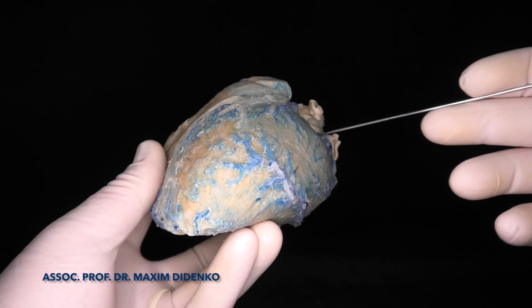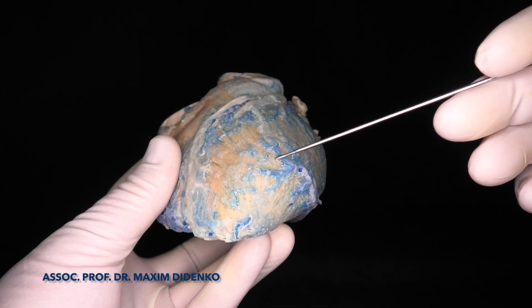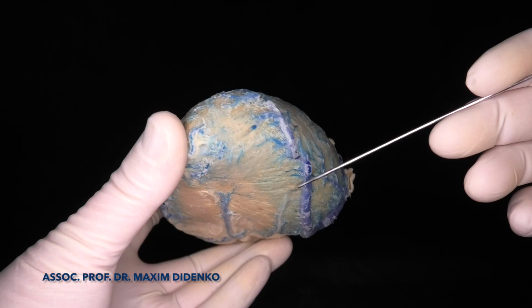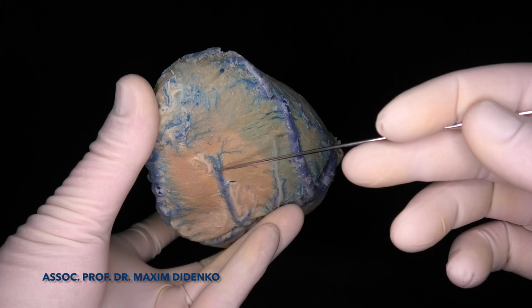We can also say, if they are located in this area here, anterior lateral veins, then lateral veins, then posterior lateral on this surface, posterior and middle cardiac vein here.